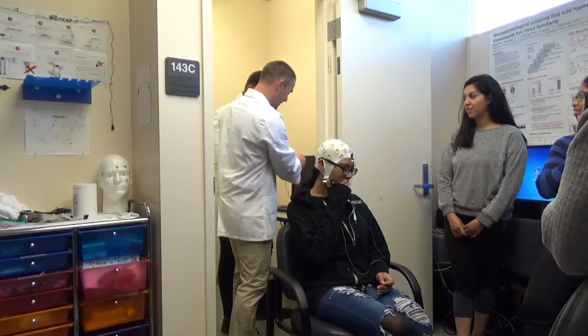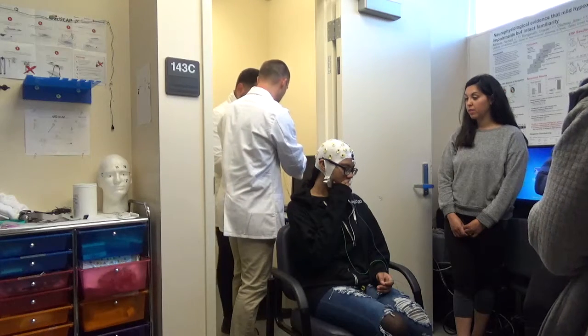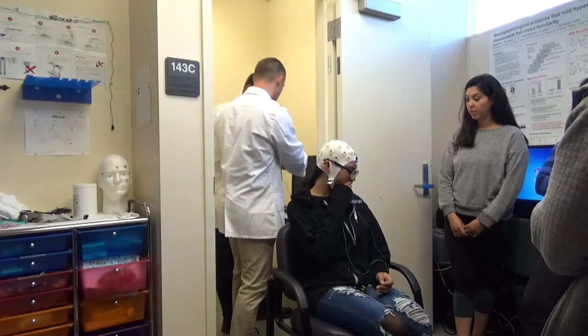Upper is green. Okay. Lower's red. Lower's red. Okay, thank you. And then black's in the middle. Okay, I can see that. Okay.